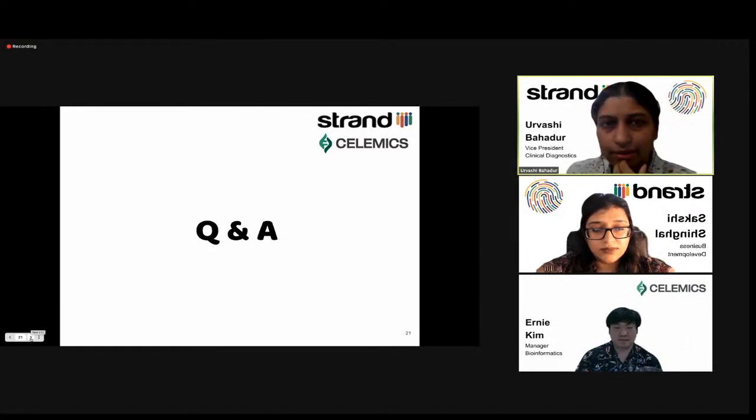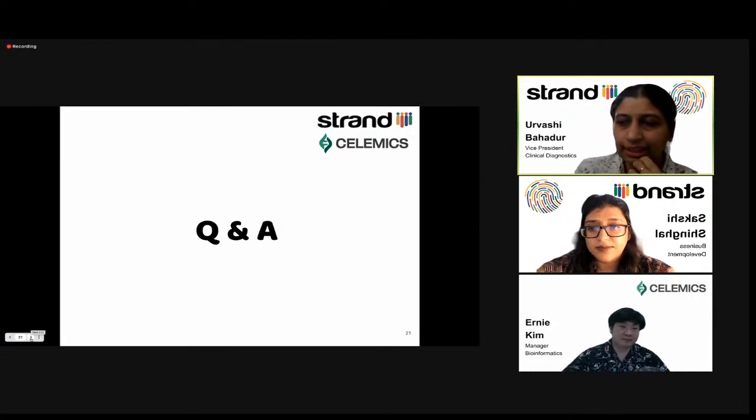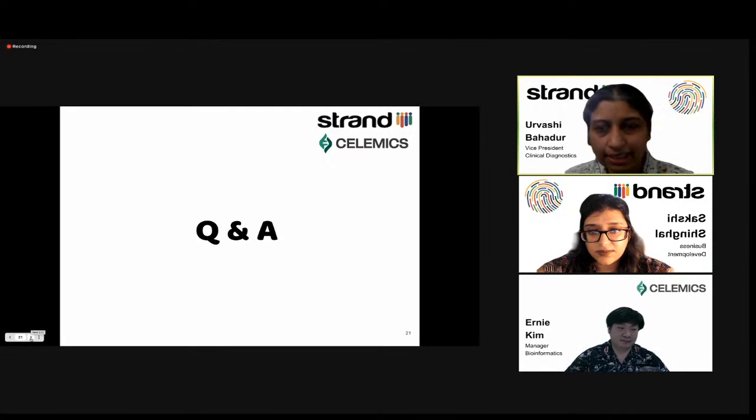Right, so I can explain what we do, and then I don't know if Ernie wants to answer something as well. It depends on the secondary pipeline, of course, but after that we can take a look. Typically what we've seen is that some variants which come very frequently are systematic errors, these are panel artifacts.